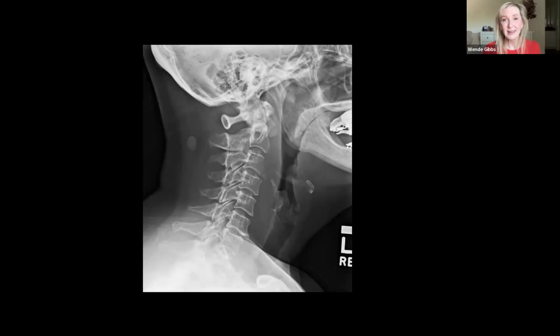So in this case, X-ray, bones. Bones all look really good. Normal vertebral body height and alignment, normal disc space height, no advanced degenerative changes. So what's wrong here? What else can we see? We see that she has abnormally thick prevertebral soft tissues, way, way too thick. I don't usually use these measurements, but a rule of thumb is if it's thicker than the width of a vertebral body, I don't know if the surgeons use that, then it's too much. But just looking at this, you can tell it's too much.